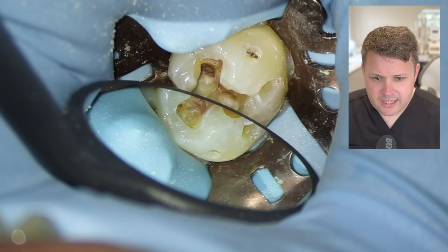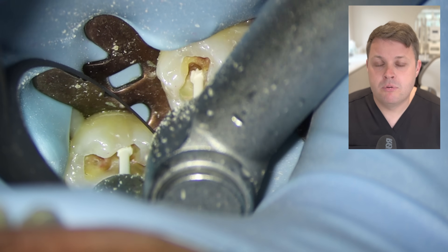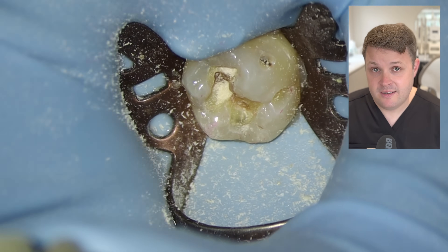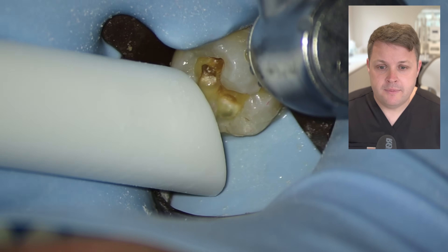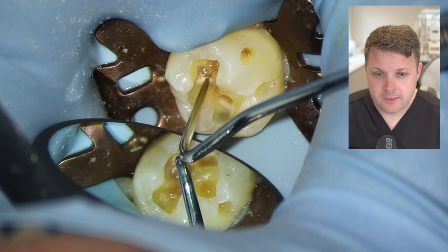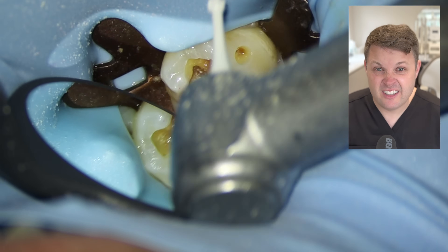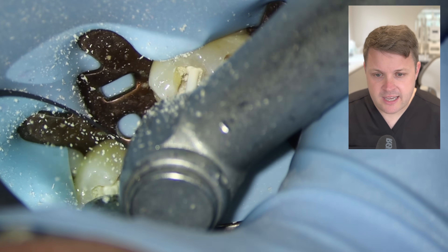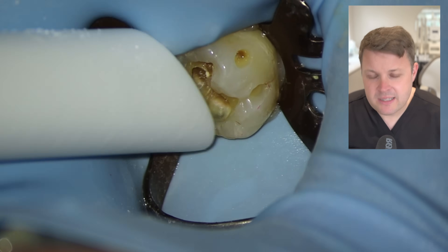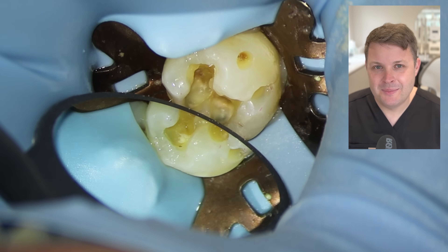When I first qualified, I liked to remove all darkened dentin. But I've noticed in practice this is probably the removal of too much sound tooth tissue. You've got caries-infected dentin and affected dentin — it's about being conservative and not drilling too far into the pulp. I'm using a probe here to scratch around and assess whether this is genuinely affected dentin rather than infected.